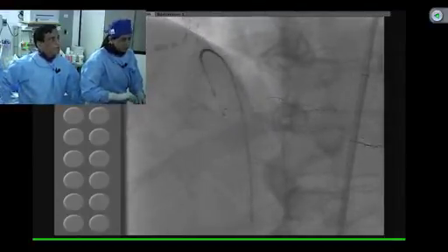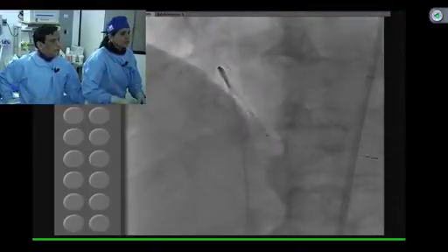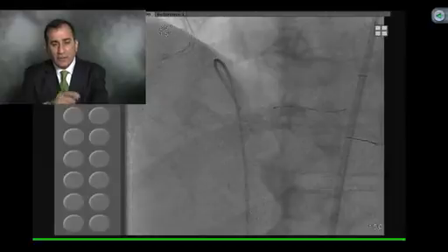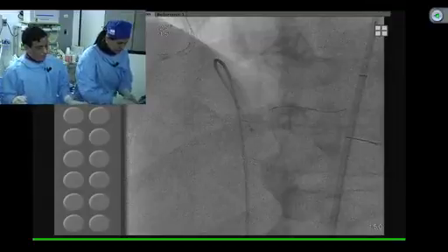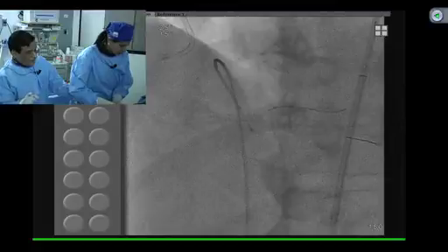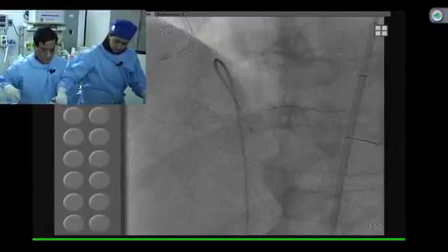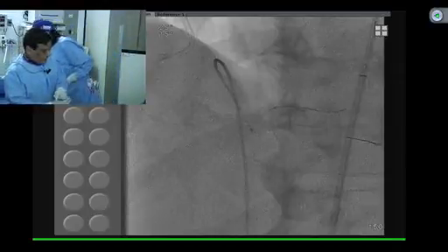2.5/23. So, Samin, tell me, how does it happen? You're going to exchange it for a 2.75/23? Yeah. So what happens? Who's charged for it? That's very interesting actually, and we have to be thankful to all these device and stent manufacturers, because they will return it at no cost. Excellent. That's very important, because otherwise it will be a major issue, and that is actually the issue outside the country where patients pay out of their pocket, and that turns out to be one of the reasons in many of these cases.